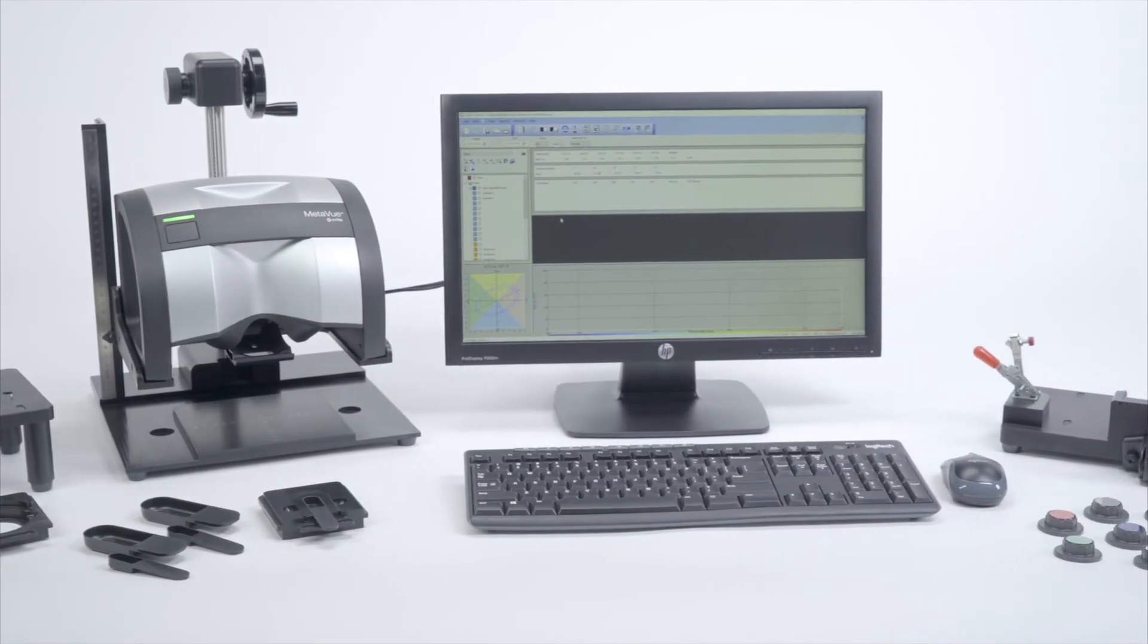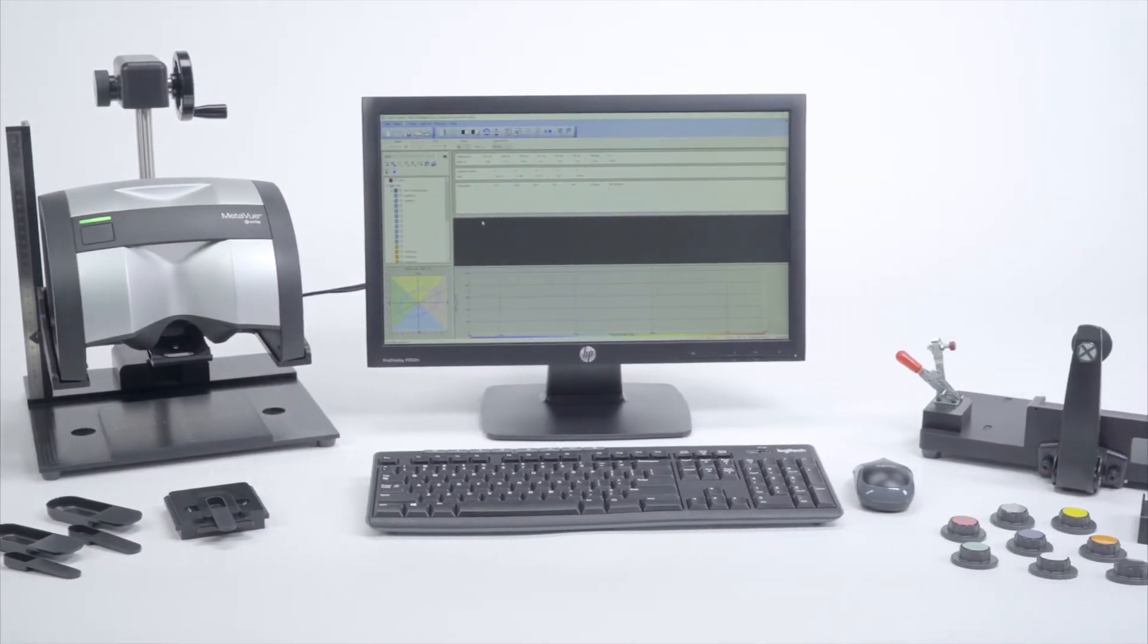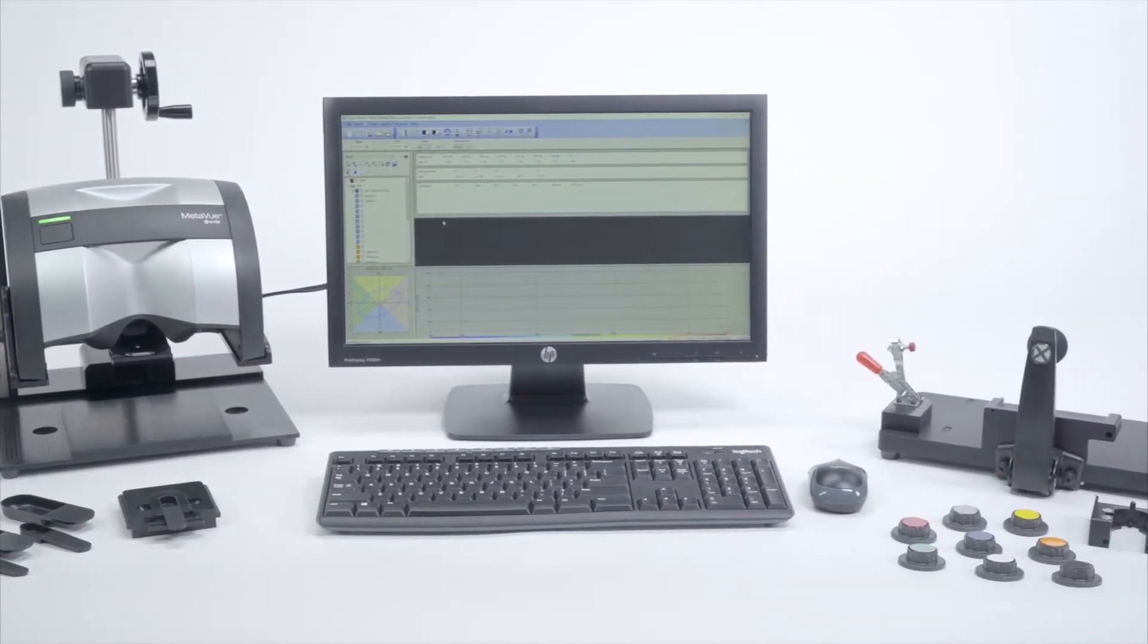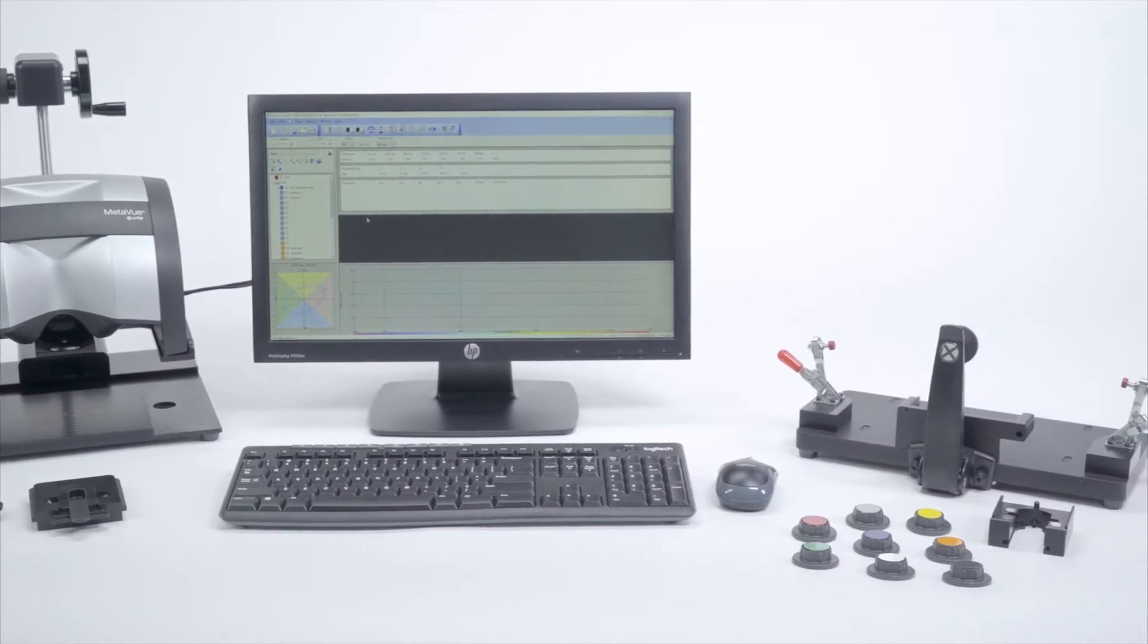Introducing MetaVue VS3200, a non-contact imaging spectrophotometer by X-Rite Pantone.